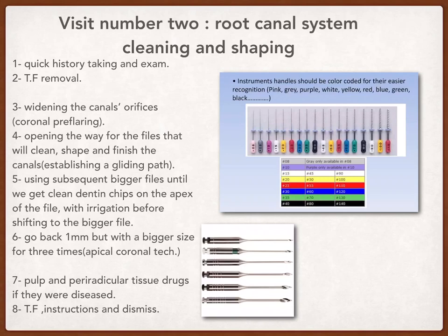Okay guys, that is the step back technique or the ISO technique.